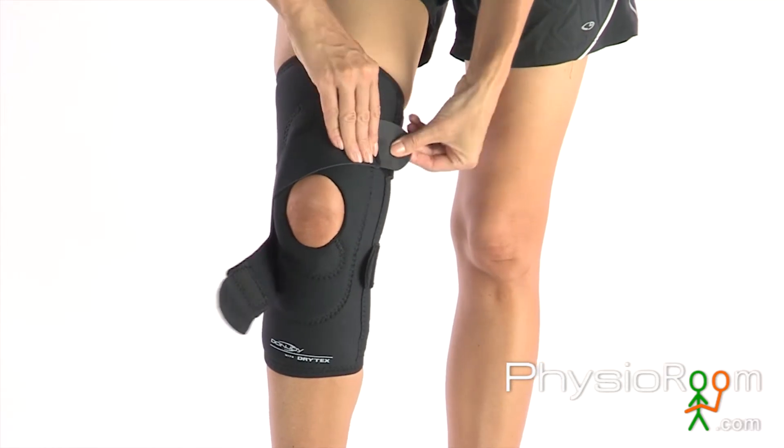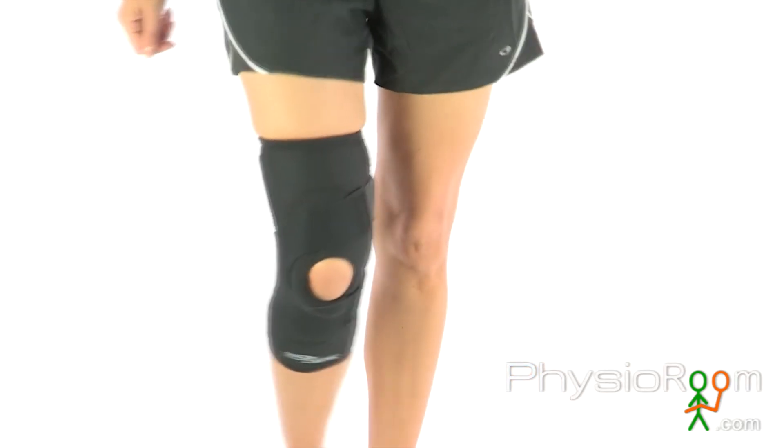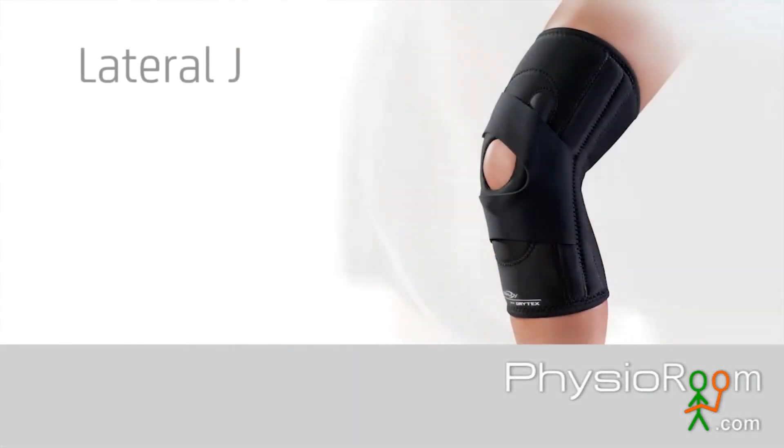The Donjoy Lateral J Brace provides enhanced knee stability so you can get back into action confidently and comfortably. It can be worn at home, at work, or during sports, and is available in left or right versions.